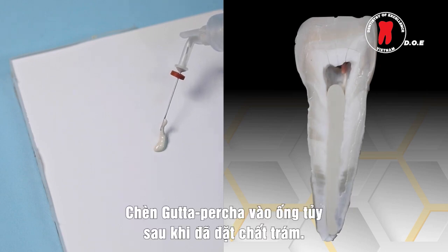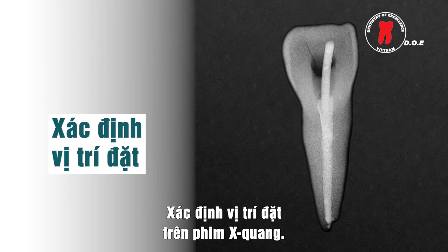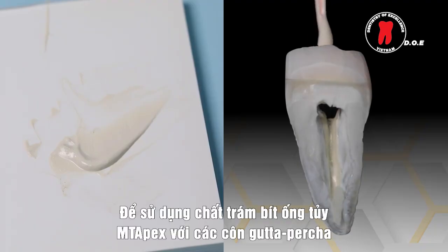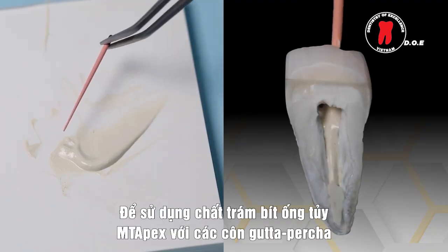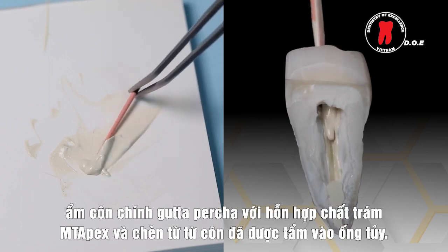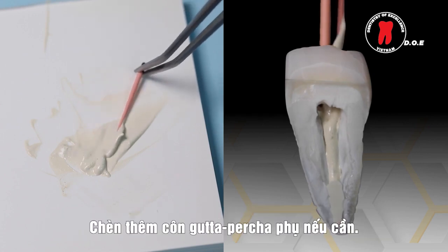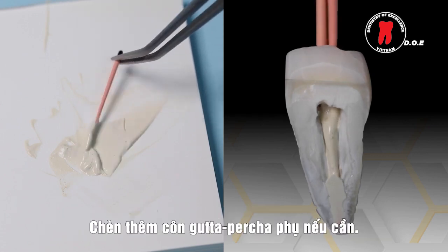Gutta percha is inserted after the canal is filled. Confirm placement with a radiograph. To use MTApex sealer with gutta percha points, coat the master gutta percha point with the mixed MTApex sealer and slowly insert the coated point into the canal. Add auxiliary gutta percha points as needed.